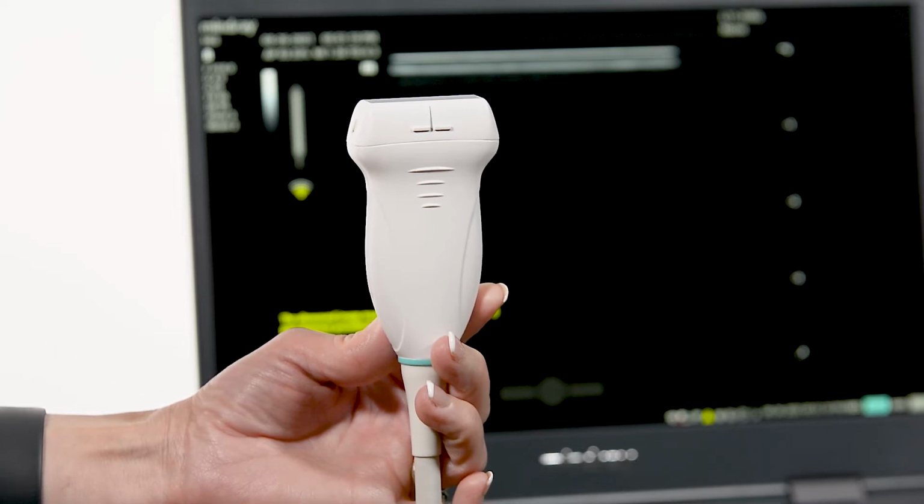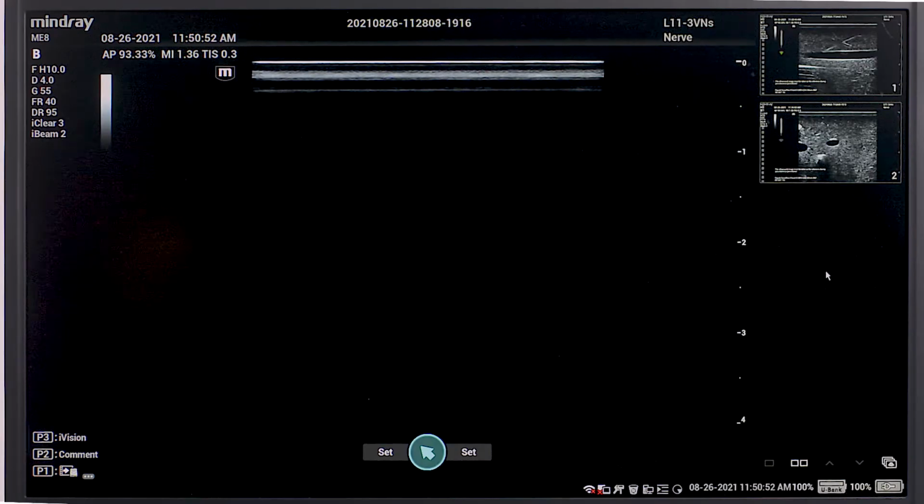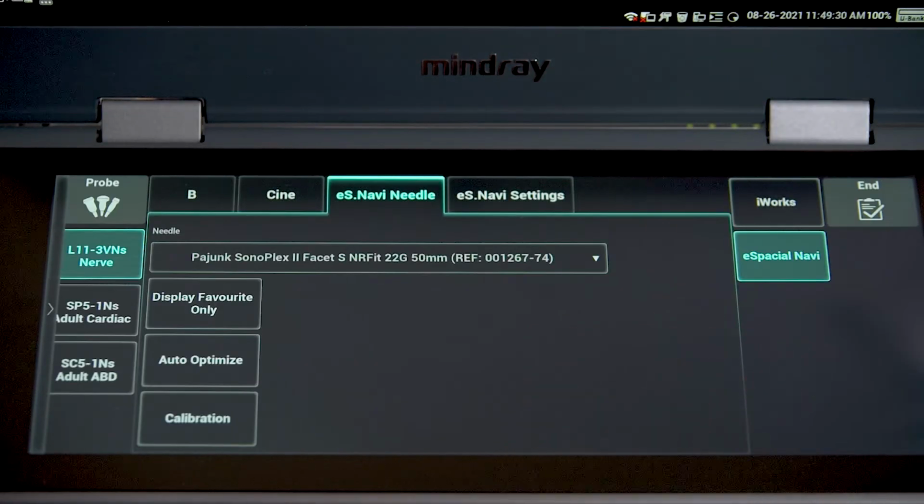Make sure the transducer indicator notch is toward the left of the screen during calibration. The notch correlates to the M on the imaging screen. A message will appear when complete. Recalibration should only need to be performed once each day, or if a different needle is chosen from the list.